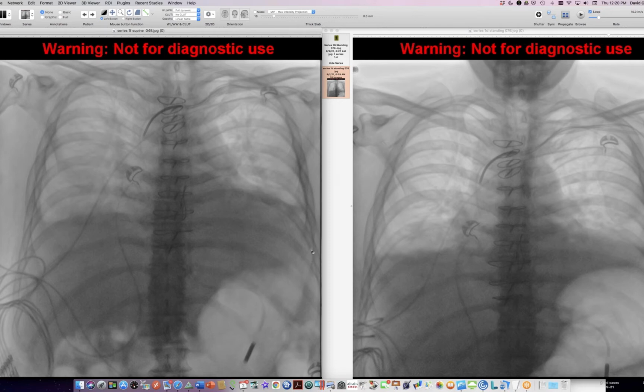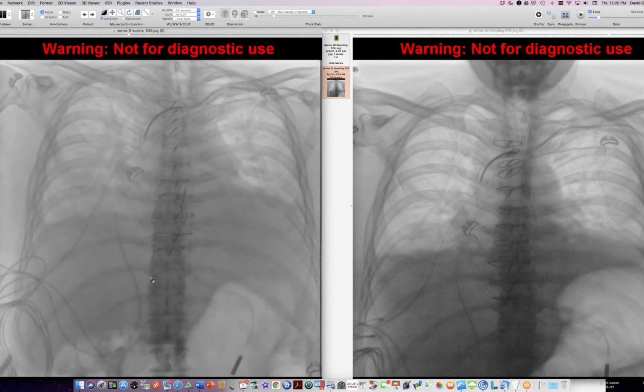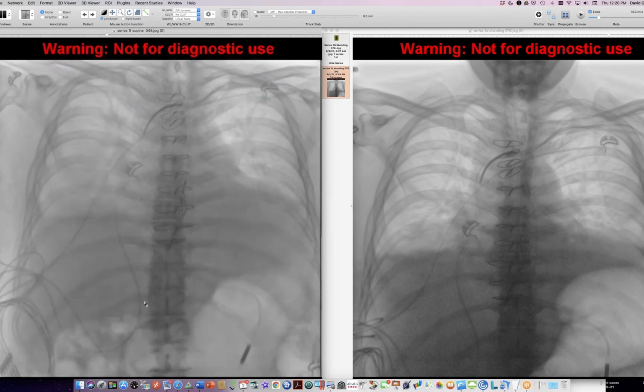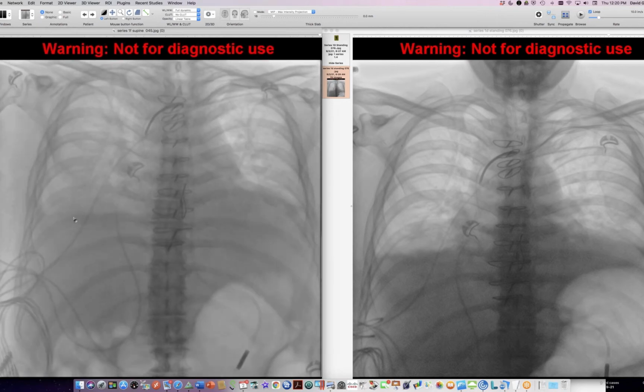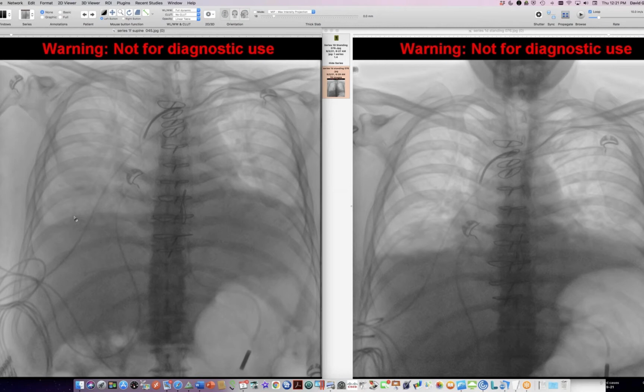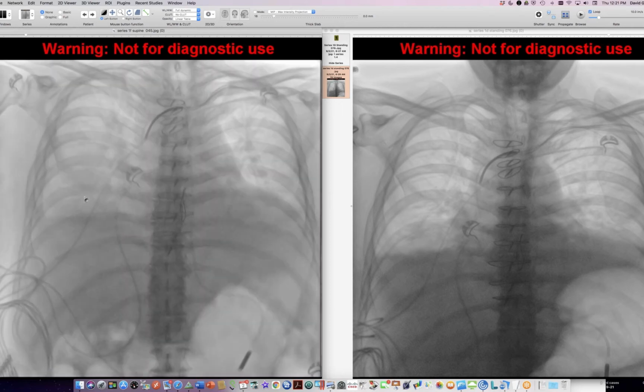Then I tilted the patient down to 45 degrees and then eventually to supine. And this is the supine view now, when the person takes in a series of deep breaths. And you can see that there's now almost no respiratory motion here. There's almost no motion of the diaphragm. And if we actually look at the motion of the diaphragm, if you look at the right hemidiaphragm, it actually goes up when the anterior ribs are going up. So it's being dragged upward by the anterior ribs.